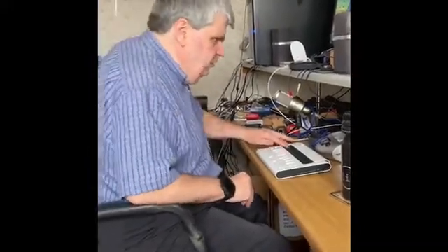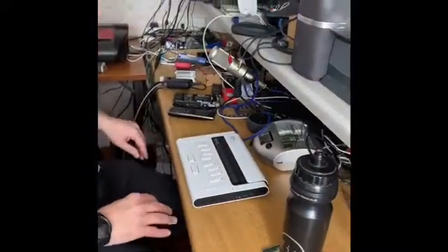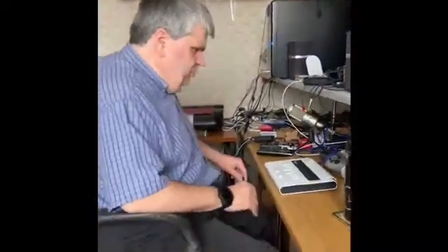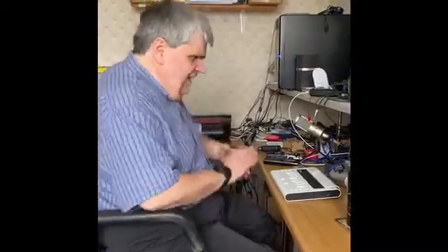And in Braille, on the left hand edge of the Braille display, it says left bracket B2 right bracket, which means Braille grade 2. So you always know what grade you're typing in. And it can also transcribe. So if you typed in grade 1 by accident, it can transcribe it back to grade 2 and so forth. So that's the first environment.